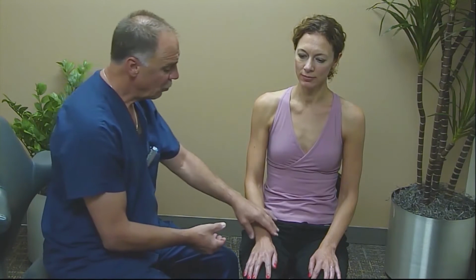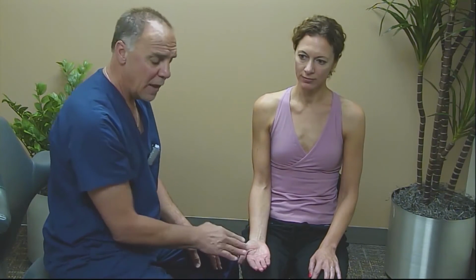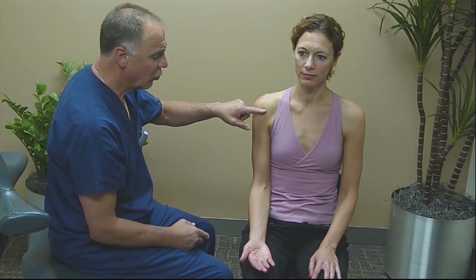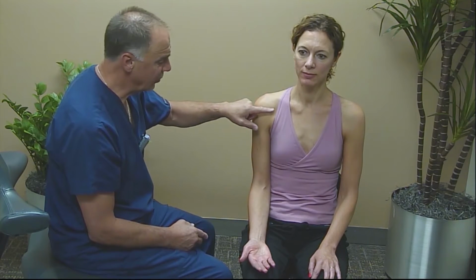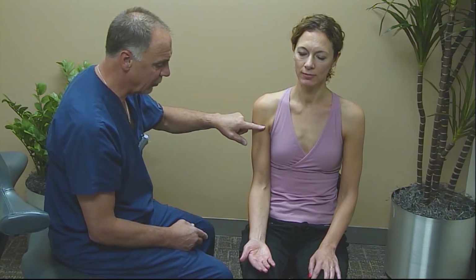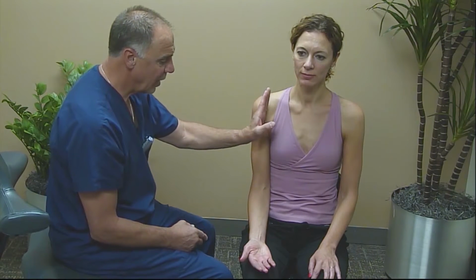In order to view that, I ask the patient to bend their arm at 90 degrees, place their palm up, and comfortably lie the hand on top of the thigh. What that allows us to do is place the transducer in a position so that we can look at the long head of the biceps tendon in its short axis all the way down to the pectoralis major. We can then look at the long axis in the same position.